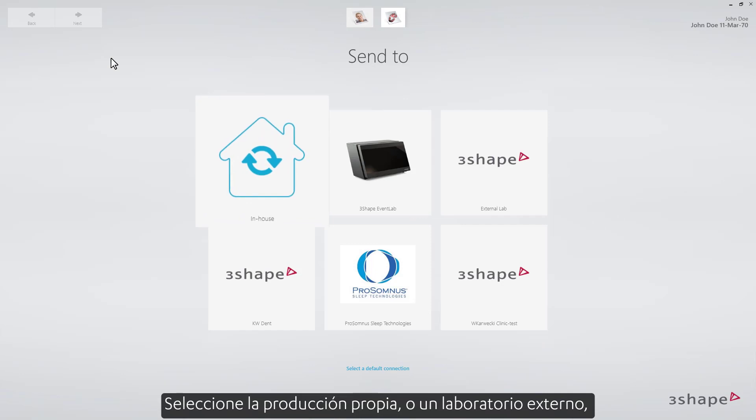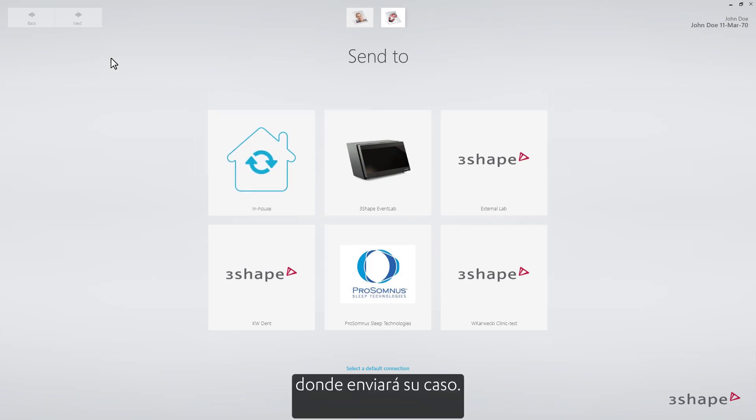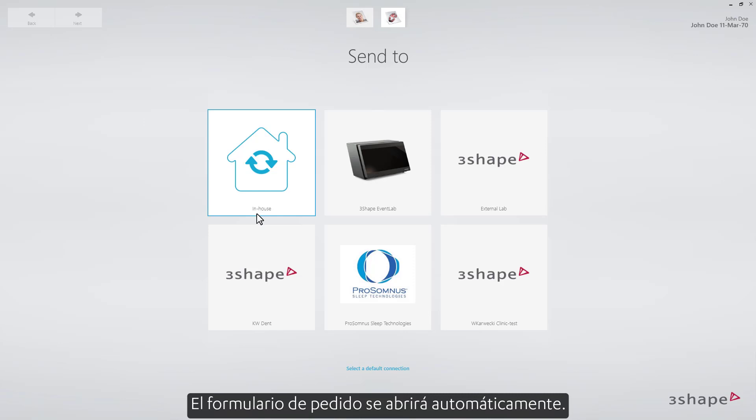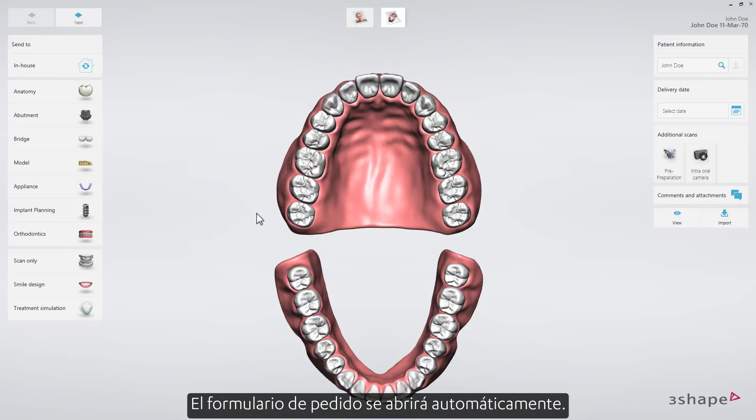Select In-House Production, or an external lab where you'll send your case. The order form will open automatically.